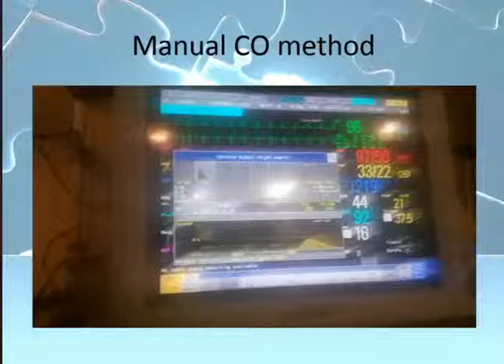But the other thing is that, and I say this in balloon pump class, if you have an ICP, intra-abdominal pressure, a CVP, or an arterial line, you should be printing a strip out on your lines at least once a shift, because this can document if something should happen to that line, say the patient kinks it or something like that.